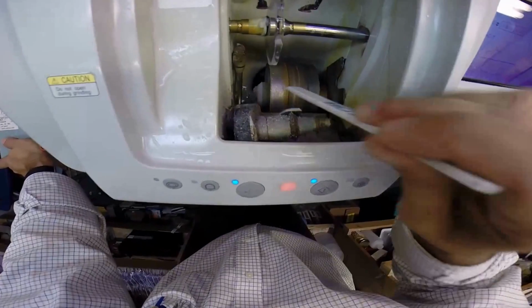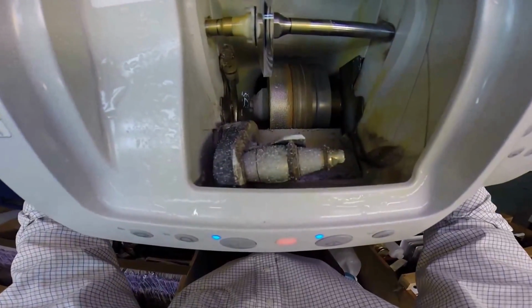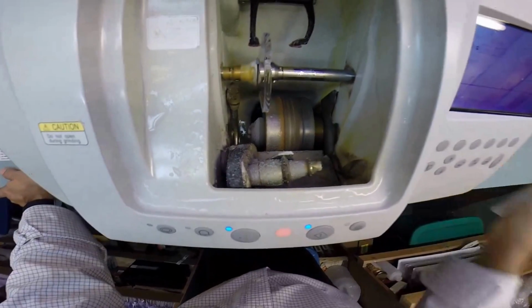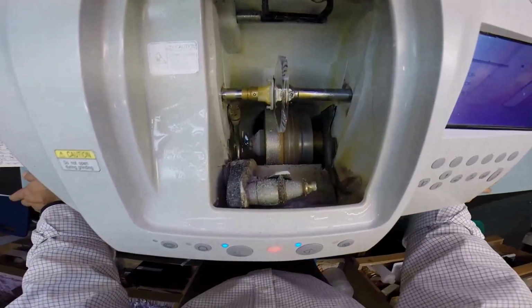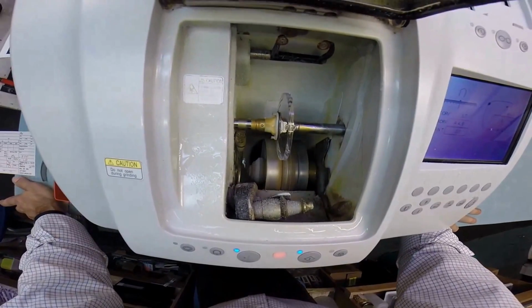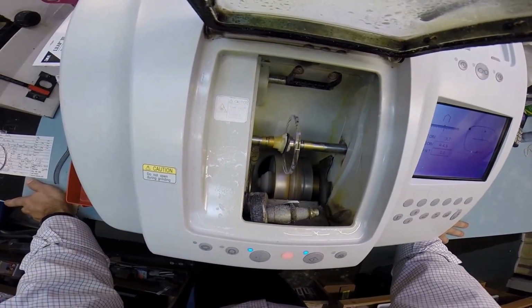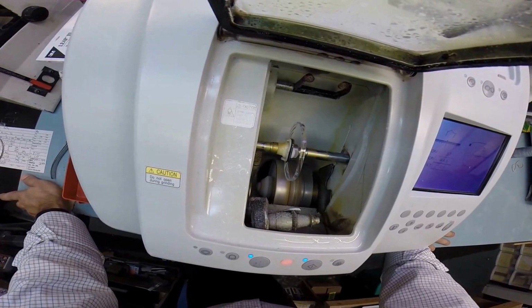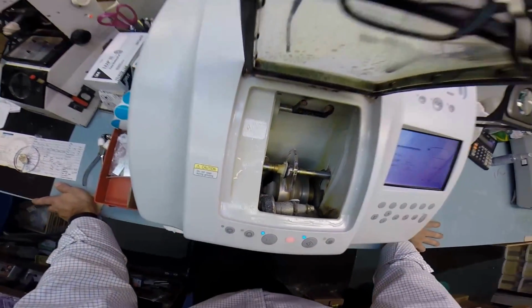The cutting wheel is down here on the bottom left. It's that lighter color wheel that's going to act like a heavy grit sandpaper that's going to grind away your lens material. And this wheel in the center with that channel, that little valley, that's what's going to put the bevel onto the lens so it stays inside the frame. I will have to close the door in a moment, but for now I just want you to see as your prescription lens touches down on the cutting wheel. There we go.